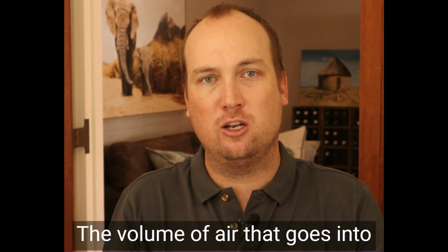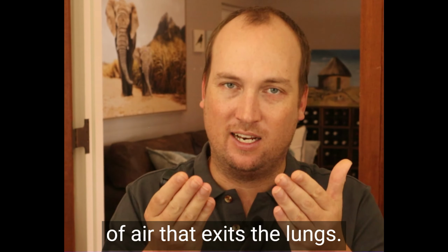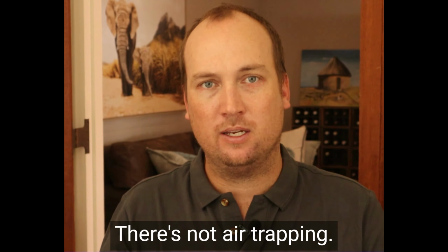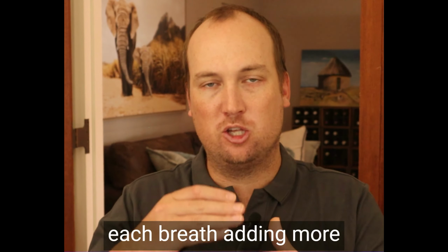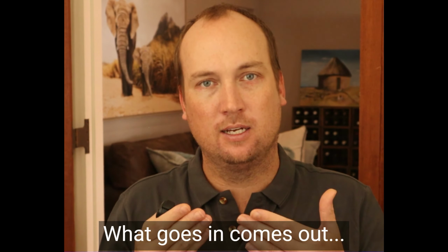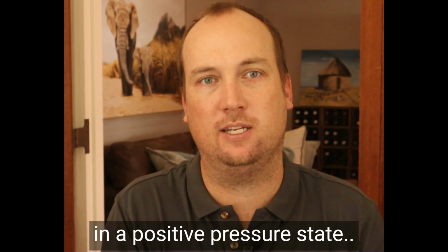It's important to remember though that even when PEEP is applied, each inspiration and expiration is complete. The volume of air that goes into the lungs is the same volume of air that exits the lungs. Okay, there's not air trapping. It's not like we are with each breath adding more and more air to the system. What goes in comes out. It's just that the lungs are held in a positive pressure state.